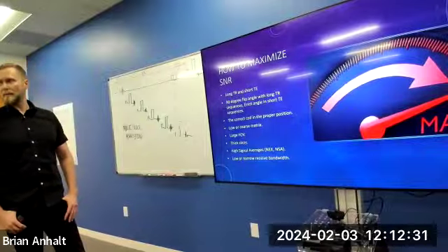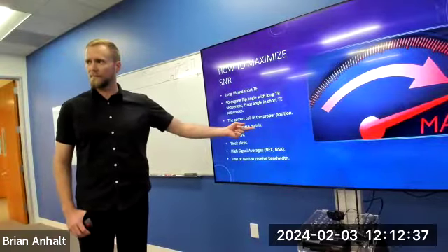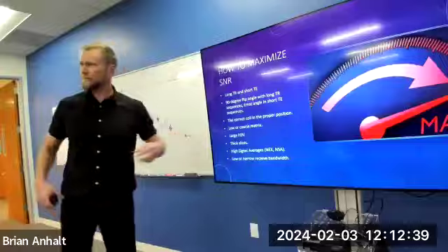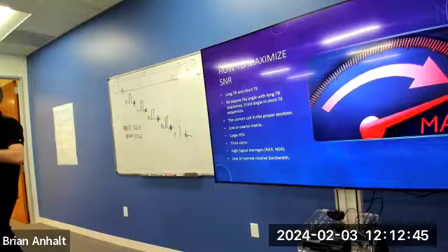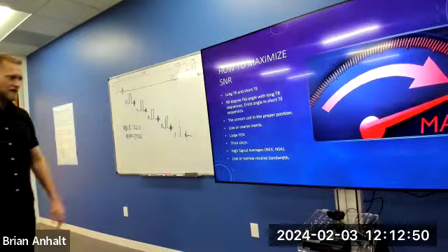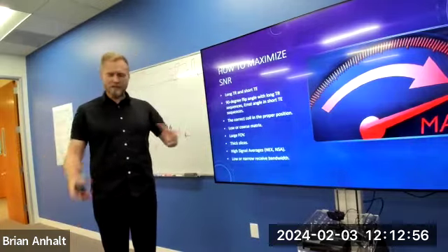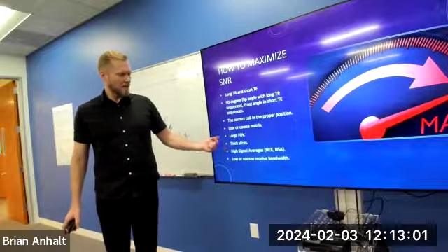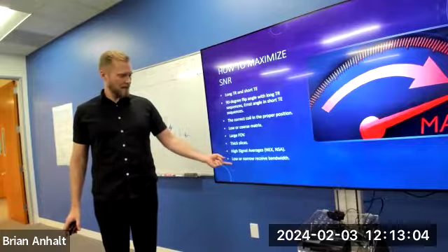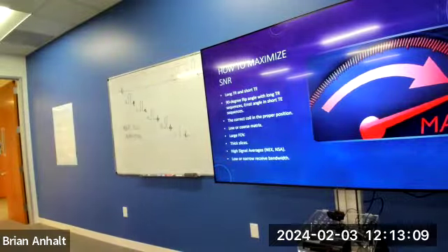The correct coil in the proper position. Low matrix or coarse matrix, right? What does the coarse matrix do for us? Gives us larger voxels. Gives us larger pixels, which in turn is larger voxels. Large field of view gives us larger voxels as well. Thick slices, larger voxels in the depth area, right? High NEX and low or narrow receive bandwidth. So of all the things we've talked about, that is what gives us the best SNR.